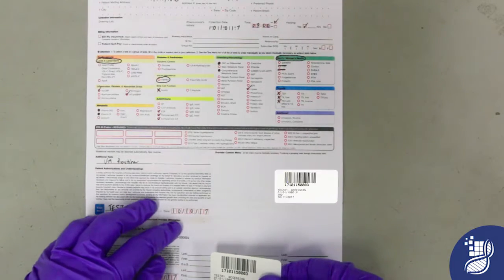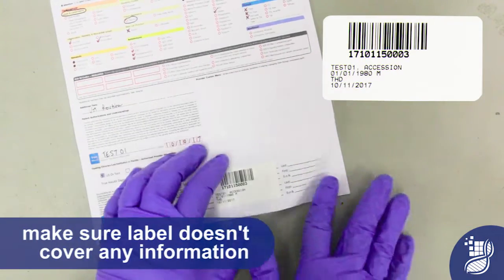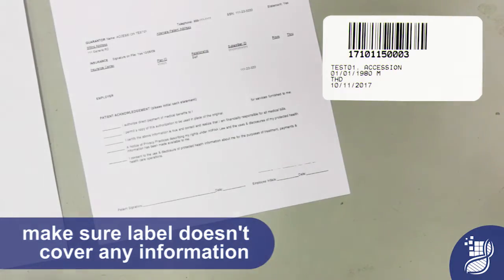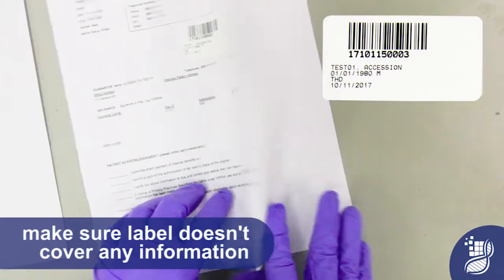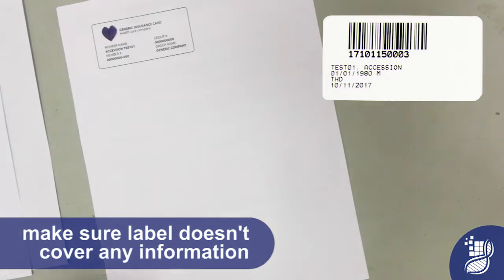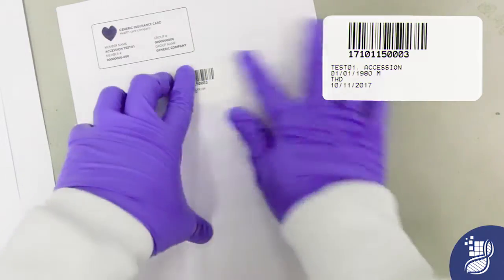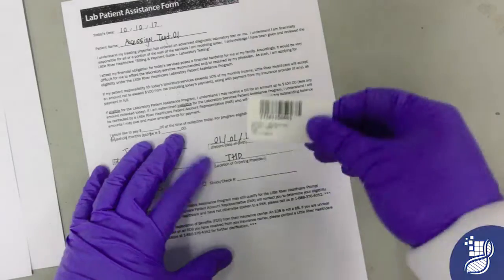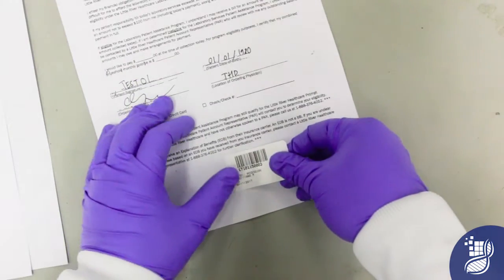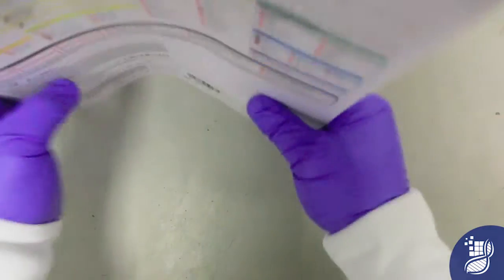You will begin by labeling all paperwork that accompanies the patient's tubes. Remember, all paperwork will be labeled using the master labels. Be sure to place these labels in a horizontal fashion in a clear spot on the paperwork whenever possible, so as not to cover any printed information. As you're labeling the paperwork, be sure to re-verify the patient's identity by comparing the name and date of birth on the label with the name and date of birth on the paperwork.